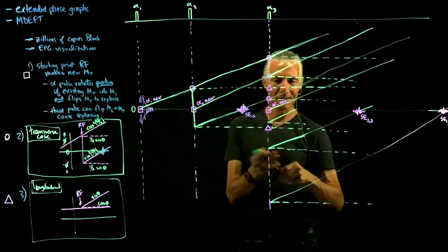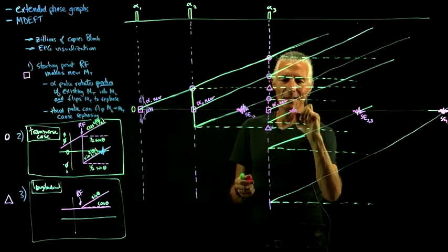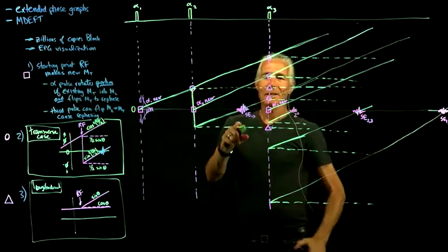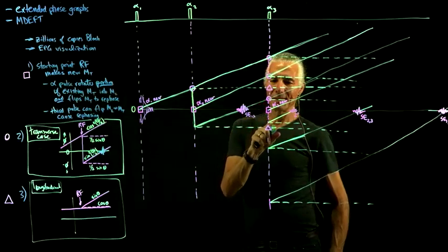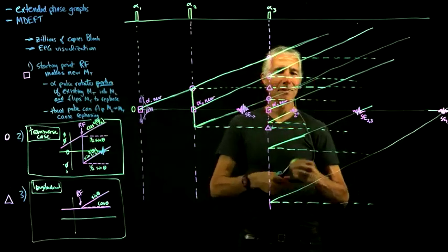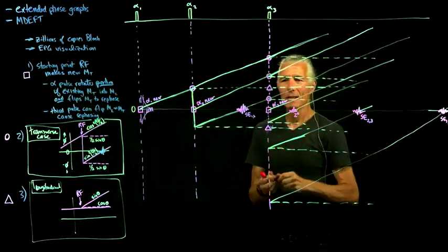So there's another echo there. That one's called the secondary echo. That one kind of treated this echo as if it was an FID, and then it rephased it. So that was the secondary echo. That one continues up into oblivion.